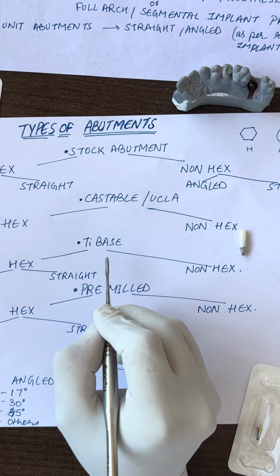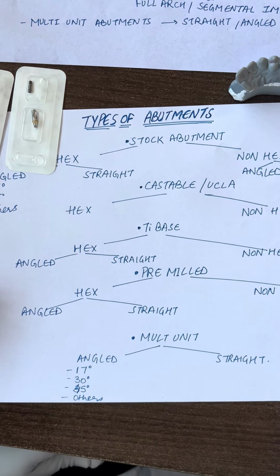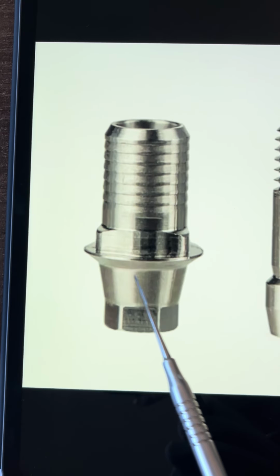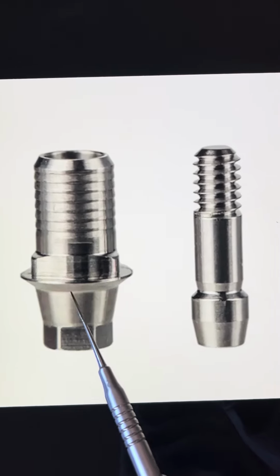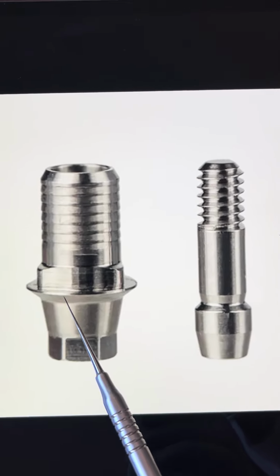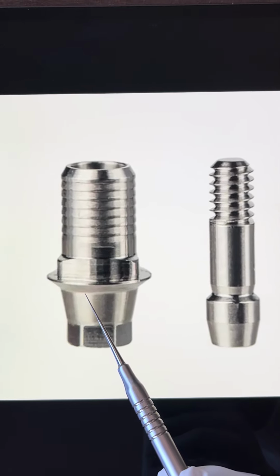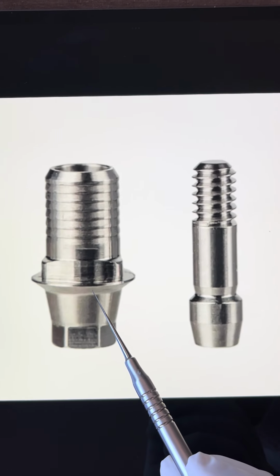Similarly, the third very important kind of abutment is the tie base. The tie base abutment can be hex and non-hex, and again can be angled and straight. You see, the tie base abutment has a titanium connector, and on top of it you will have a very customized crown, exclusively ceramic or zirconia, and this tie base abutment will have very good biomechanical strength and aesthetics, right?